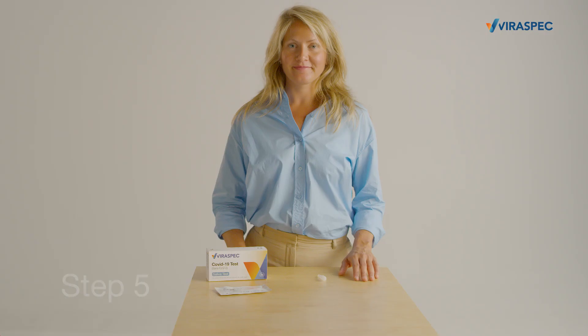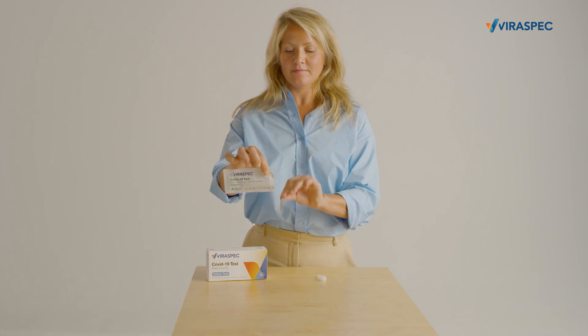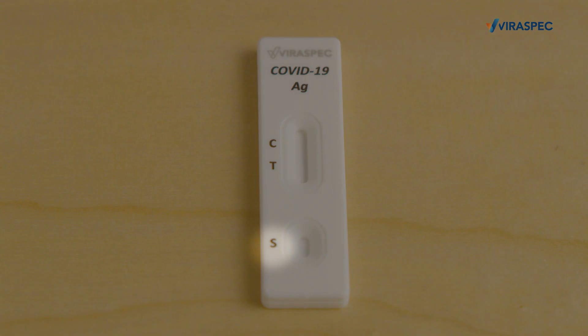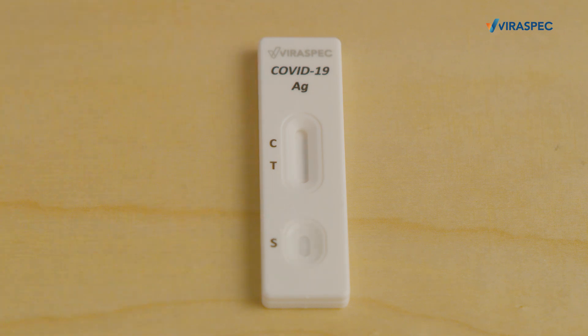Step 5: Take the test cassette out of the package. Note the sample well S area and put three drops of the content into the S area. Now you have to wait for the result to be displayed on the cassette, which takes between 5 and 10 minutes.